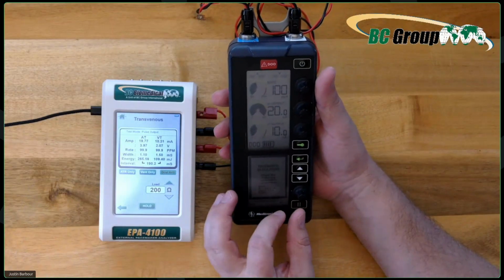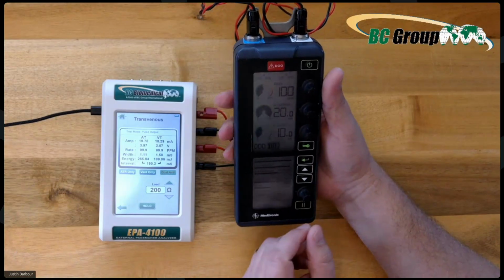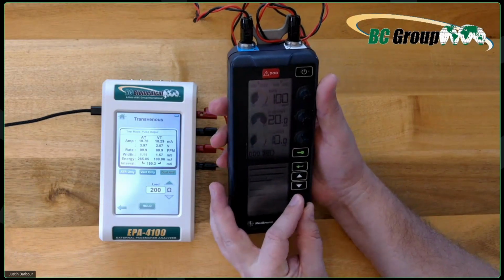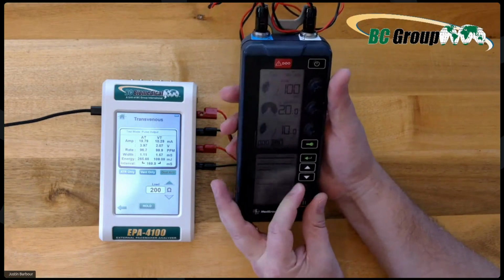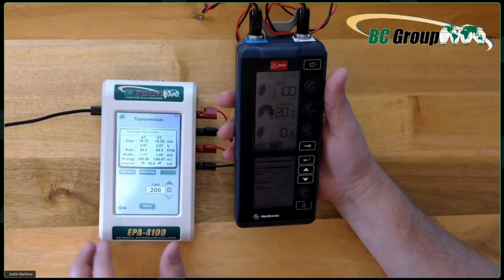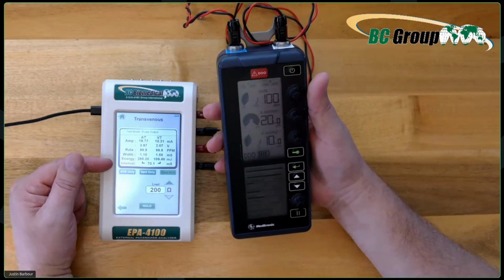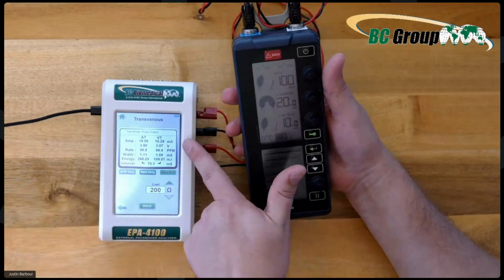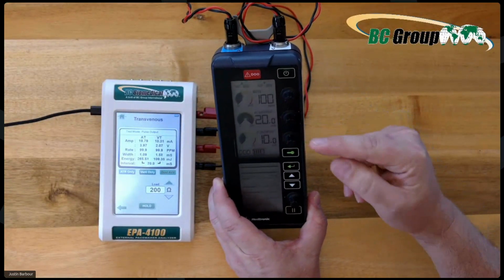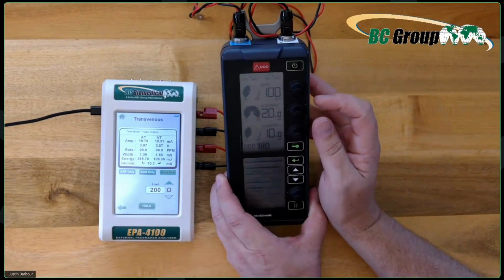So that is a long time. And what it's saying is, hey, that's not right, man, because now you're conflicting with your next contraction. So let's go ahead and turn it down. Okay, and I think I have it at 70 milliseconds. That's pretty tight on the timing. You can see right here, the interval is at 70, and I have 20 milliamps and 10 milliamps. A is 20, ventricle is 10, and you see it right there.